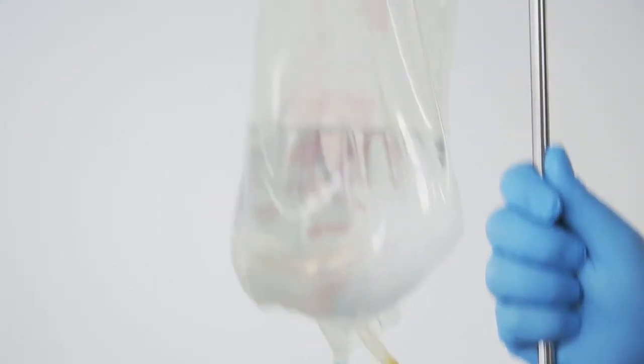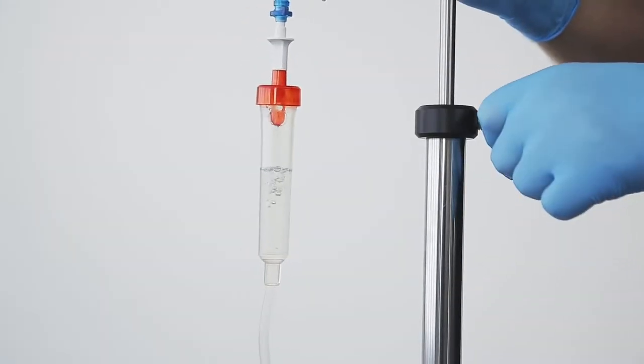Lowering of the water source to the patient's level will stop continuous flow and allow for precise drop by drop control of irrigation.